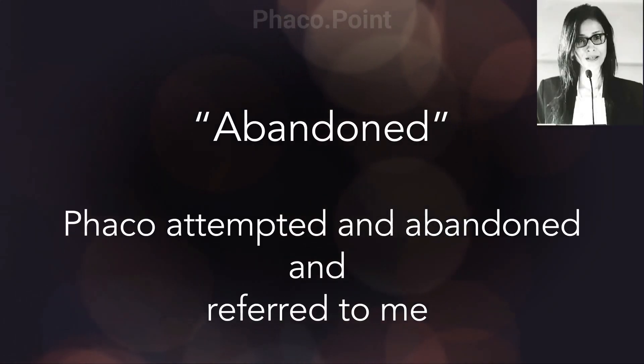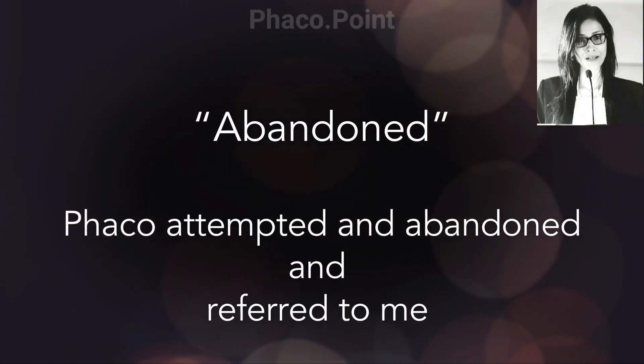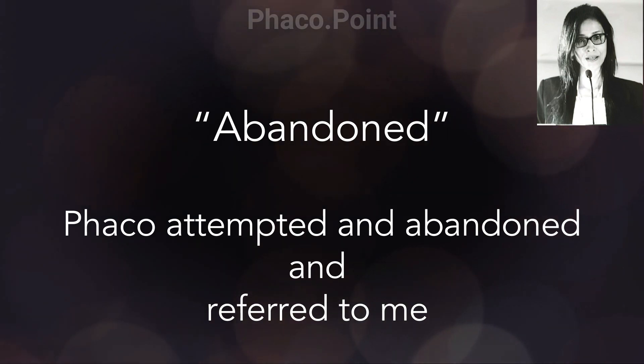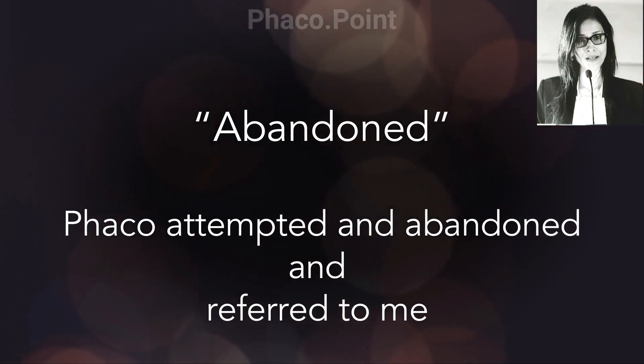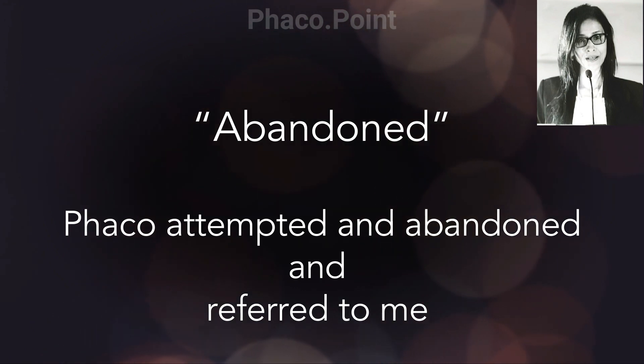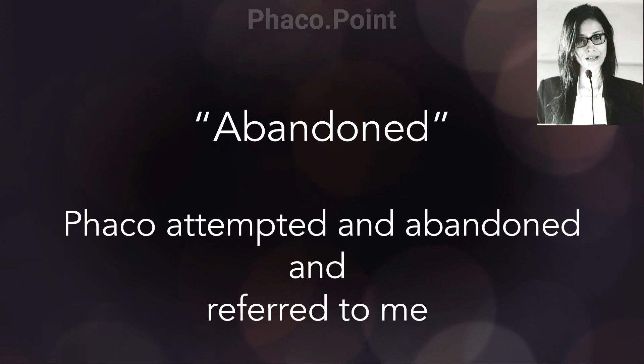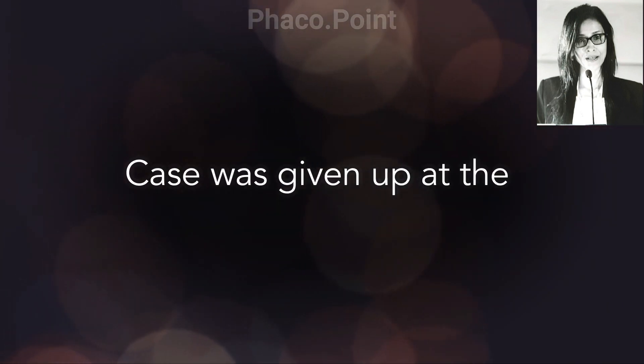In this case, I'd like to share with you a very interesting scenario. This patient was operated elsewhere 4 days ago and the surgery was abandoned. The surgeon had come to the point of partially completing the capsulorhexis, after which, because of limited visibility as the pupil came down, the surgeon abandoned the case.